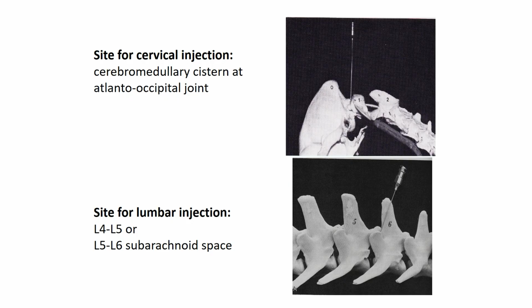After passing the needle, you have to remove cerebrospinal fluid from the space in the same amount as you want to inject contrast agent. Suppose you want to inject 5 ml of contrast agent into that space, you have to take out approximately 5 ml of CSF.